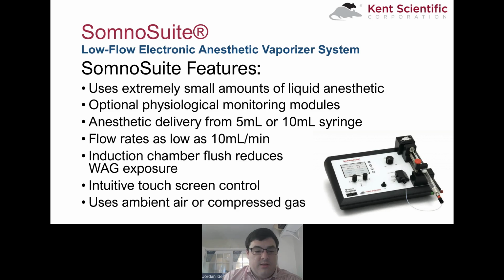When you are ready to anesthetize your animal, you will touch deliver to deliver the anesthesia, plus either the nose cone or induction buttons to turn on the flow. Both the nose cone and induction buttons can be preset in the setup tab. When you are ready to remove the animal from the induction chamber, the flush button will deliver air with no anesthesia or waste gas exposure.